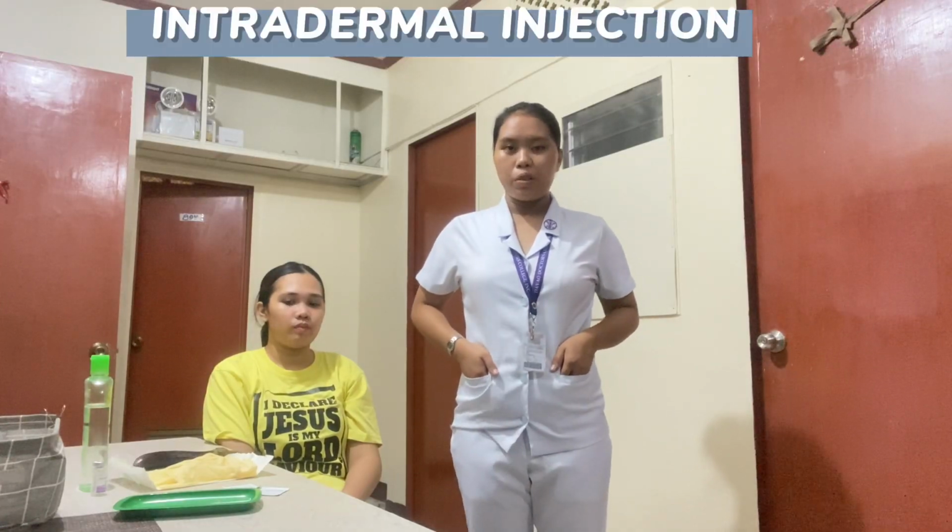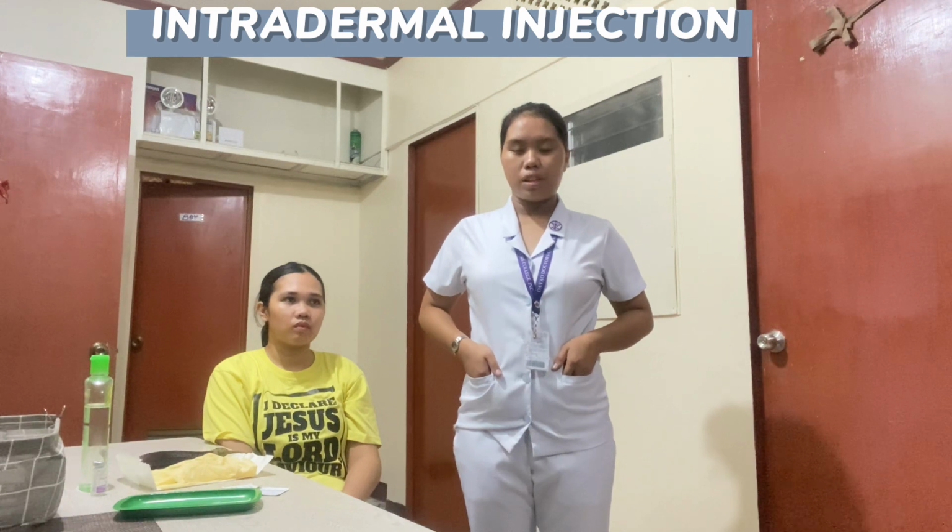So now I'm going to demonstrate the intradermal injection. Intradermal injection is the administration of the medication into the dermis layer of the skin. First, explain the procedure to the patient, or explain to the patient about the medication.